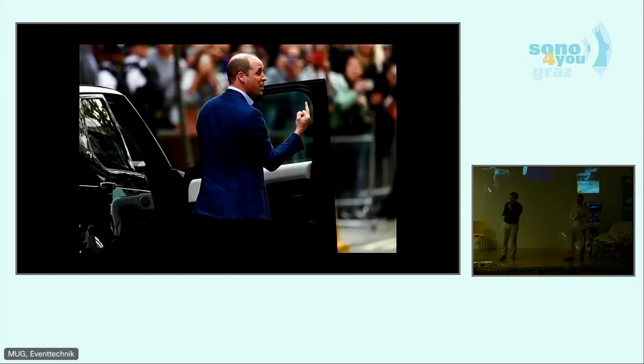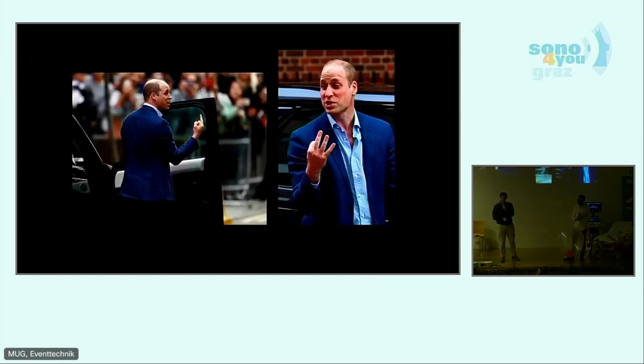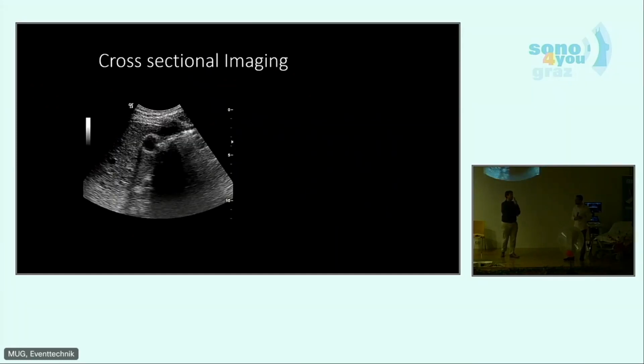What do you think of this picture? What do you think of this picture now? What does it have to do with ultrasound? You can tell me, Romeo, actually. Please describe this picture to us, especially the anechogenic structure. Oh, well, I think it may be a scan of the liver. True. And this anechoic structure, it may be a cyst or a vessel in the cross section or the duodenum in a quite clear state. But I would not be sure.